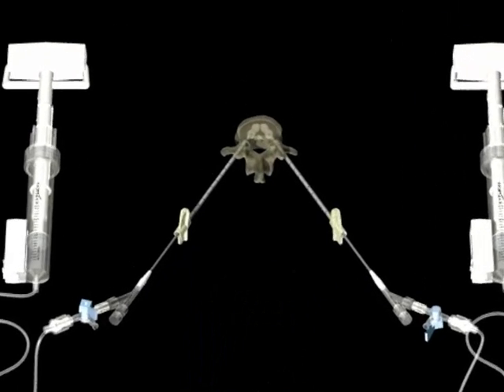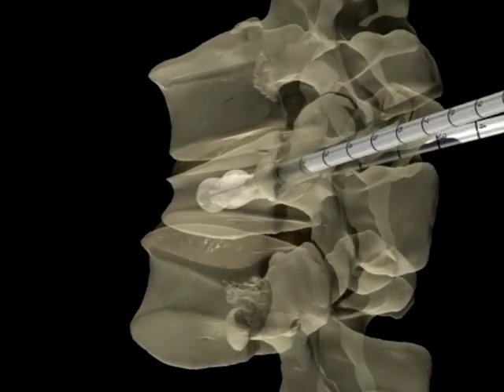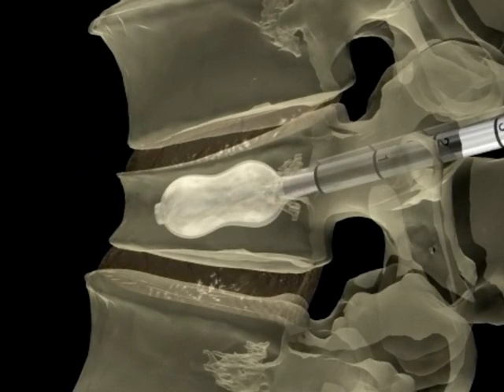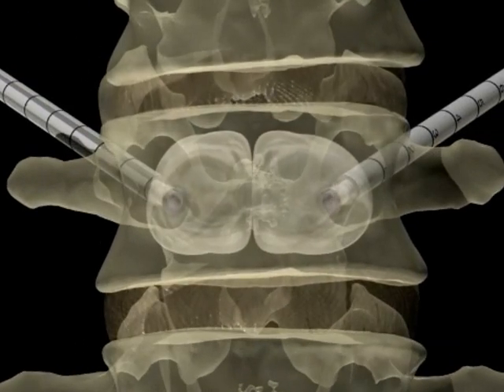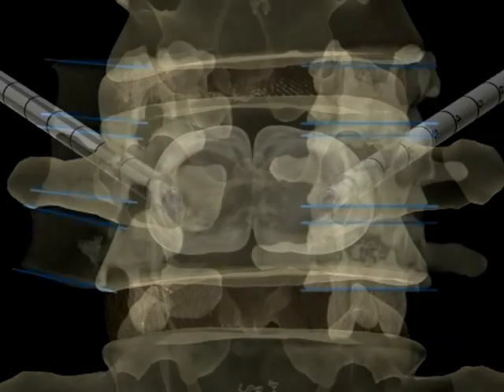Assess tamp size and position in lateral and AP views before proceeding to further volume increase. Use the lateral view to monitor distance from the anterior and posterior cortices. Use the AP view to monitor the lateral cortices. Continue to inflate and monitor the IBTs until an inflation endpoint is reached.